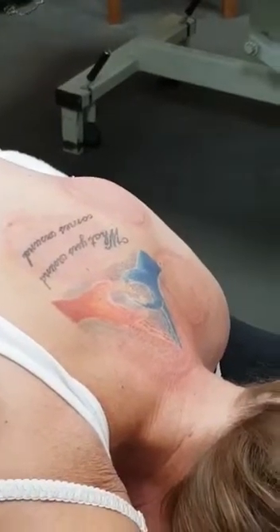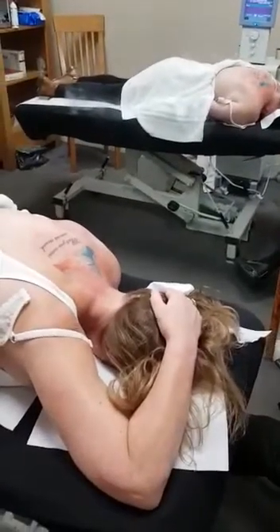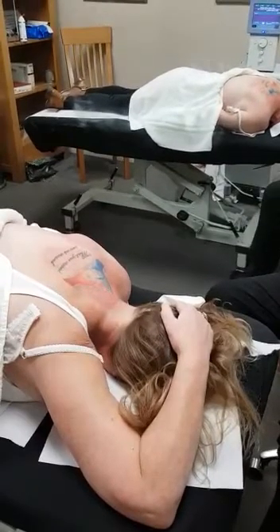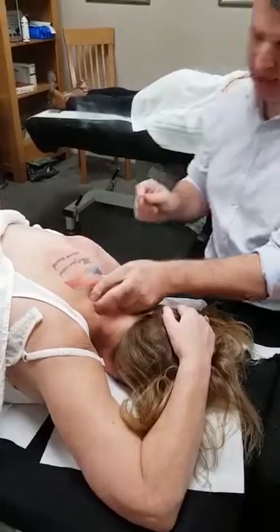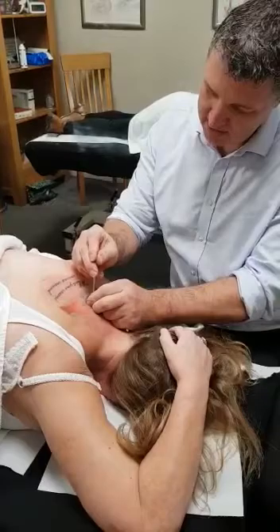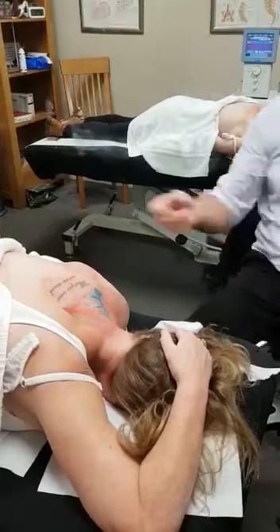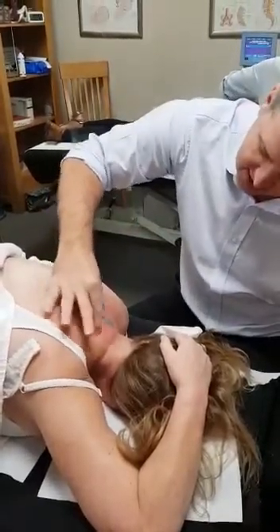That's that feeling as you're just jumping and going into a good position. Do about seven or eight, nine, then change the needle — keep it nice and sharp. You can get a bit of bruising sometimes, especially when you do it for the first or second time. This is the first time you've been up this high. And you can actually feel, before you even needle in this area, how thick this tissue is around that area.